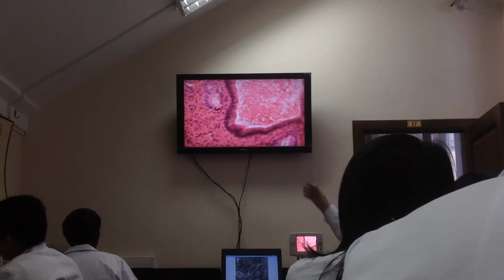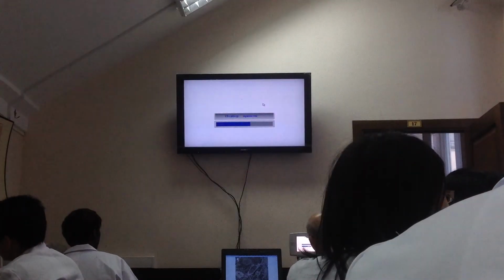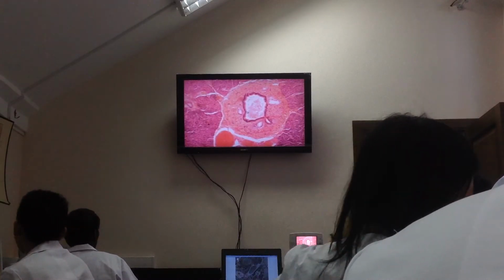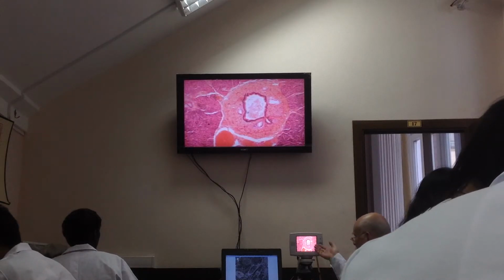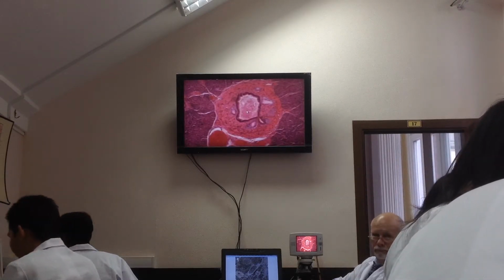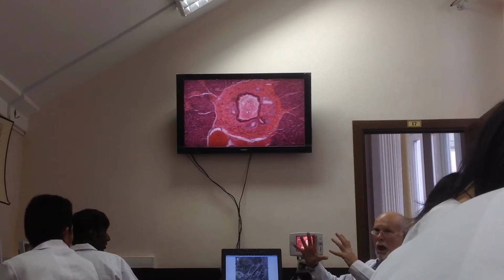And the cavity. Epithelium and the cavity surrounded by this epithelium. What structure do you see? What structures are formed by epithelium in the gland? It may be acini, it may be ducts. What is this? It's a big duct. Interlobular, large, big duct.